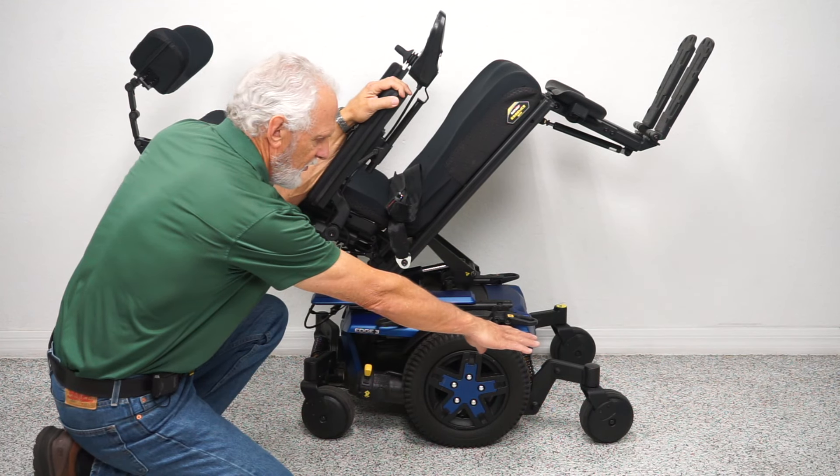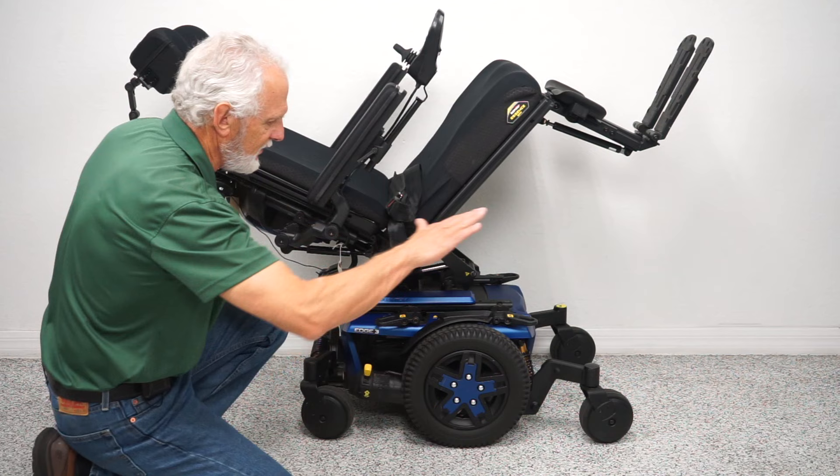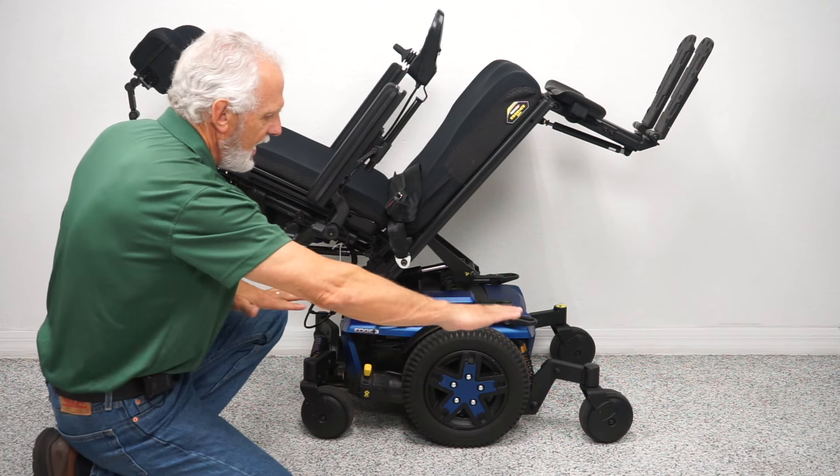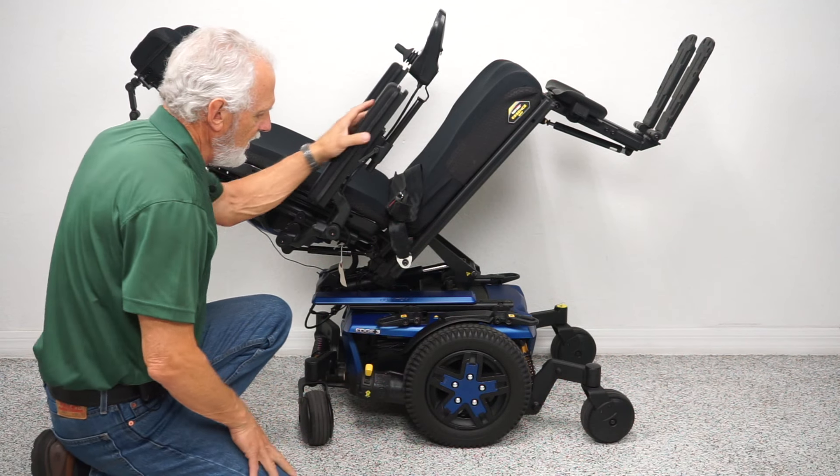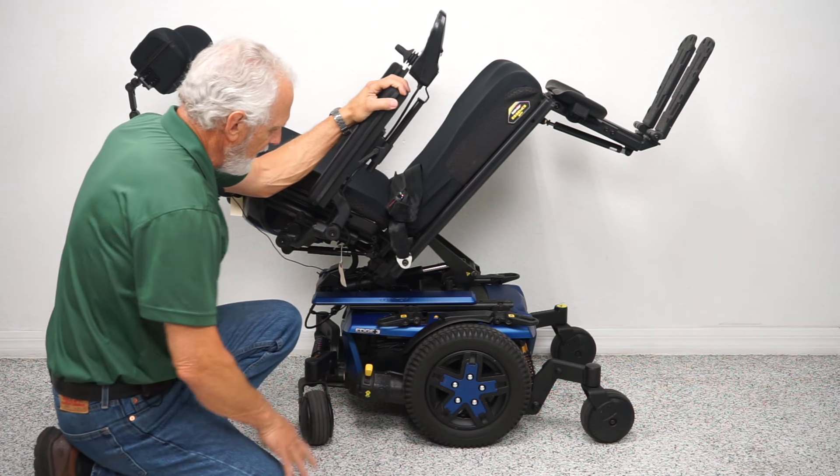With mid-wheel drive, you're always going to have a wheel on the ground in front and a wheel on the ground in the back to keep the chair from tipping. When you turn in a circle, the wheels line up, which is why you can go in a full circle without much movement.